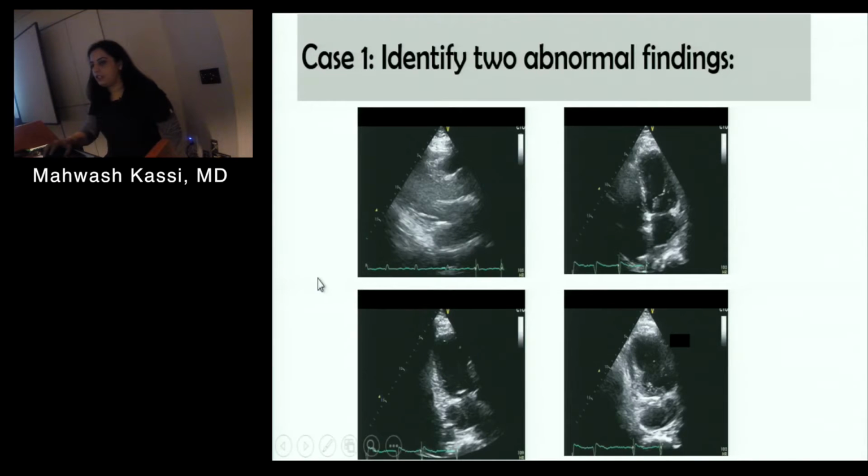So he underwent an echocardiogram. He was transferred here, and I'm hiding some of this information as to why he was transferred so that we can come to a differential diagnosis looking at this echo. So basically, just for the fellows, there are two abnormal findings. If you could locate them or shout out the answers. I'm going to go phase by phase, starting with the parasternal long view, and if any of the techs note anything that they think is abnormal, please don't be shy.